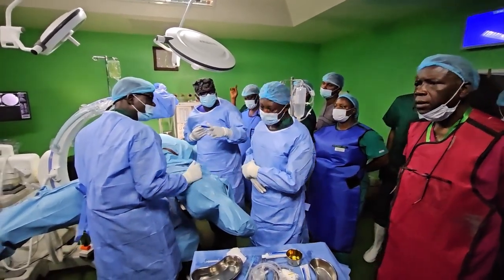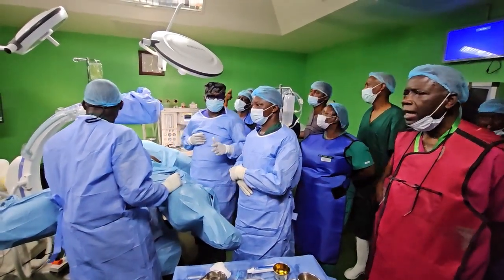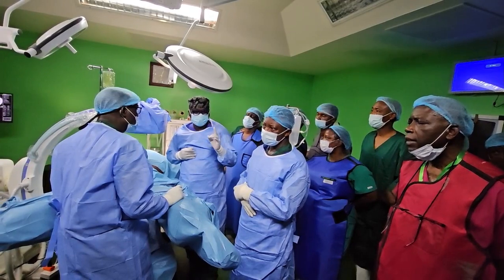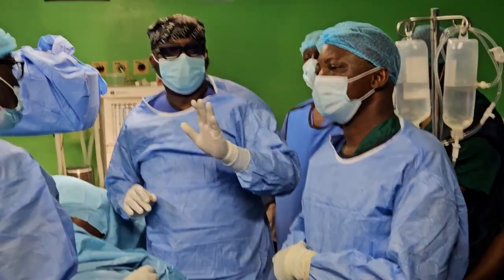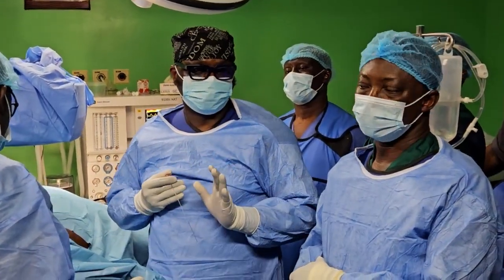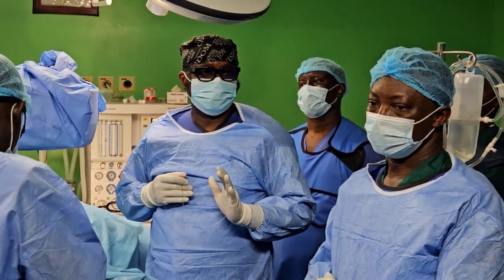Another thing you can do is always have ultrasound in the suite. If you extravasate and everything is becoming difficult with the fluoro, you can use ultrasound. Ultrasound can guide you to the depth. Okay? We have that benefit in Nigeria.